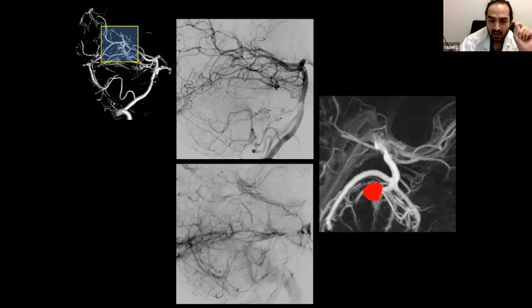So this is the AVM, okay? This is the AVM, which would be around here. And this is the initial outflow of the AVM, which is this initial little stump of the vein. From here, the vein will go in two directions. It goes to the precentral vein, but also retrograde through this superficial cerebellar vein. Now what you notice on this anatomic image is that there are actually another two veins, 1 and 2, which are brainstem veins that drain in the same spot.